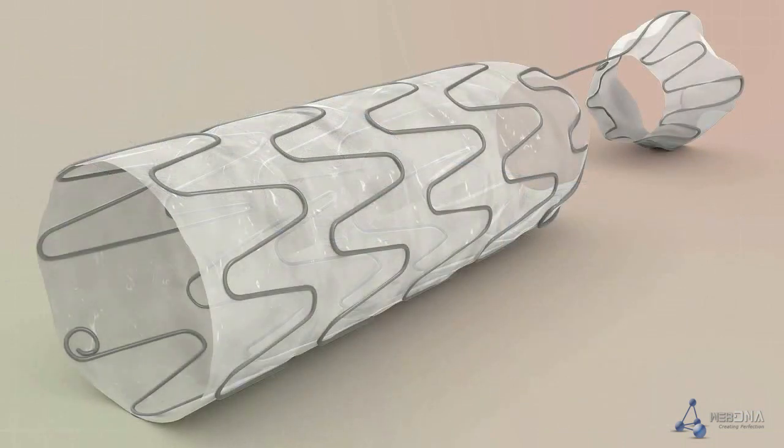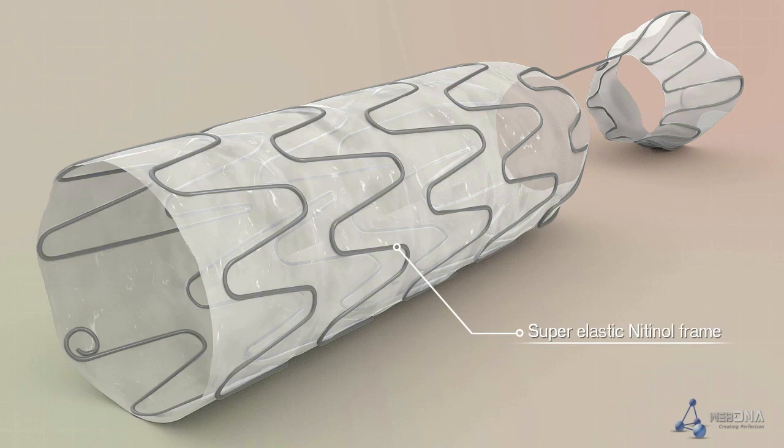Allium's proprietary polymer is embedded on the superelastic nitinol frame and is designed to prevent tissue ingrowth, calcification, and stone formation. This ensures that Allium stents can remain implanted for as long as required.